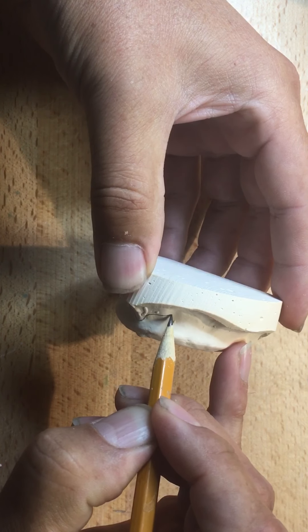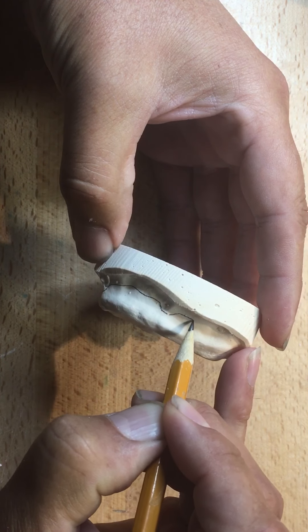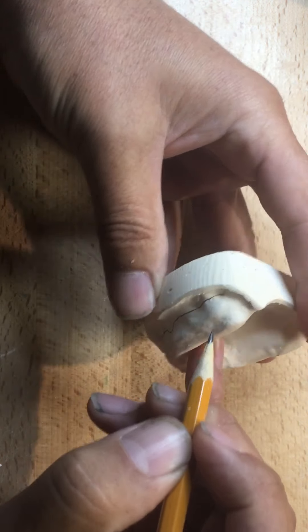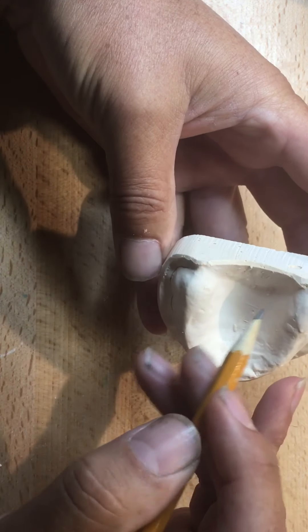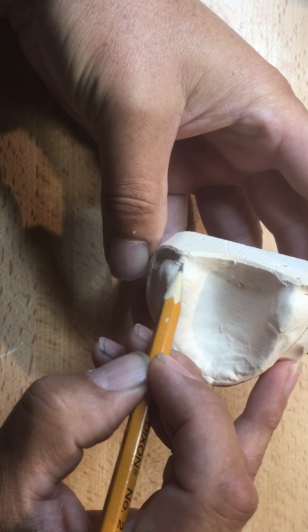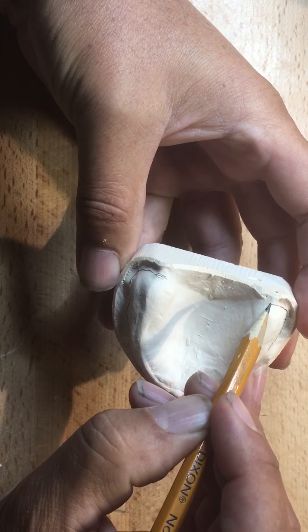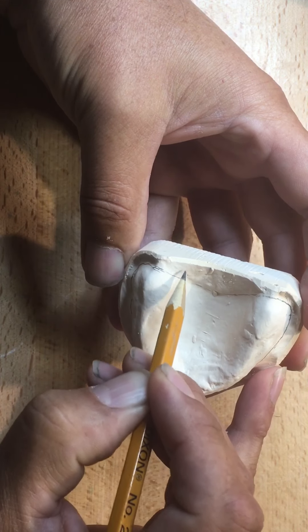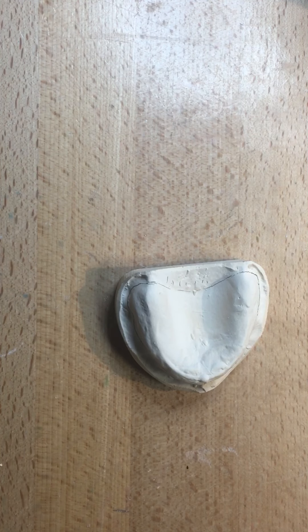And that guess is to find out where the attached and detached mucosa starts so the denture is not overextended. Inadvertently, many dentures out there in the marketplace end up overextended or underextended. And the patients just either go without or are returning to the dental offices for subsequent adjustments. So again, here I am taking a guess at the attached and detached mucosa. I'm drawing a line where I will think the denture to finish. There's a hamular notch here. It looks a little bit tight. And you can see where their old denture finished. I'm going to put the custom tray to finish around the same area.